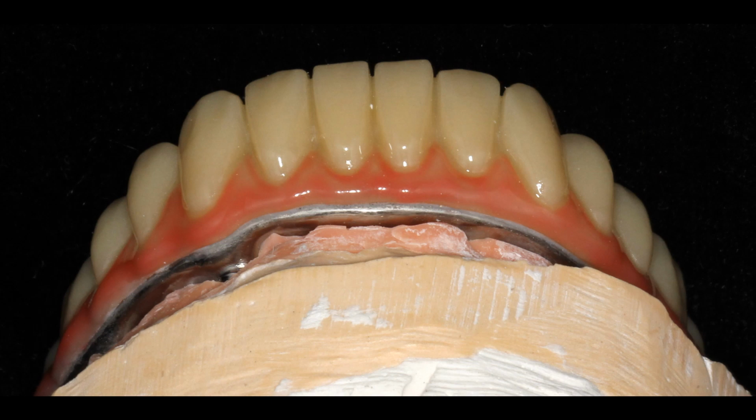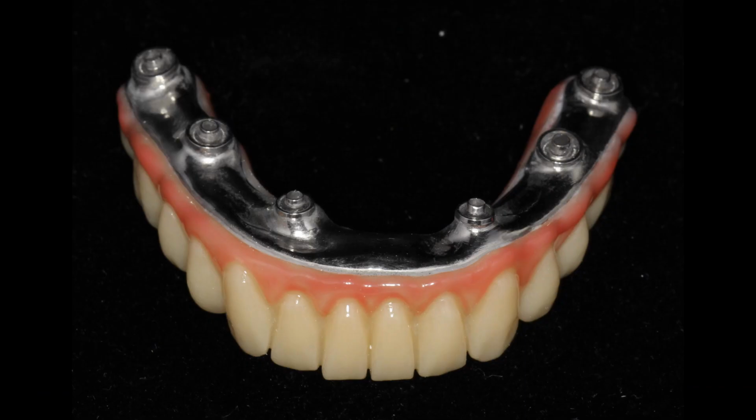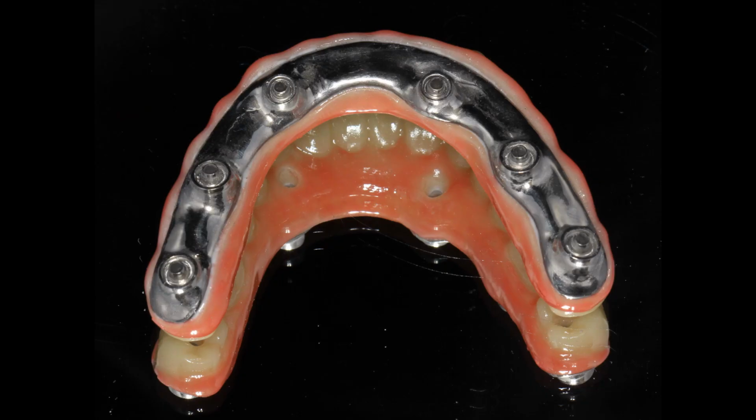This view shows you the titanium base or the titanium skeleton that supports the acrylic. This is for strength. Here's the lower hybrid prosthesis off the model. You can see the size of the titanium. It's for strength and the interface between the titanium and the acrylic. You'll notice the bottom of the prosthesis is flat to convex and highly polished, again for cleansability. This is just a fancy picture on a mirror to kind of show the acrylic and the titanium from both angles.